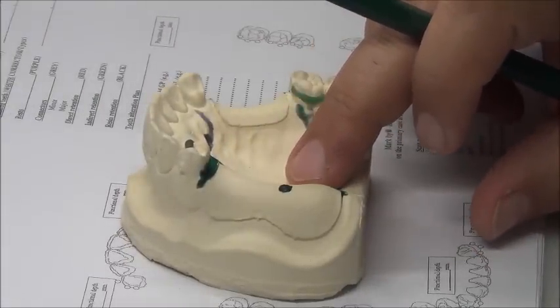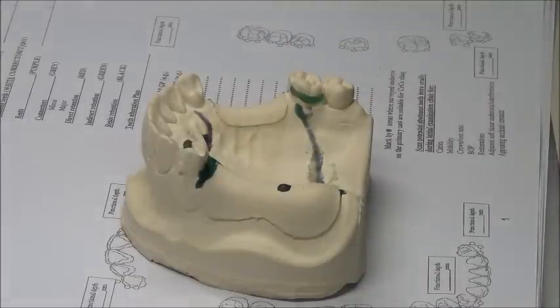Okay? We get the best support. It's the thinnest that we could produce, because it's large, I could thin it. The metal is still strong, even if I make it thin. I could mimic the palate. I'm away from the gingival margins of teeth. So the best, let's say this is the very basic design.